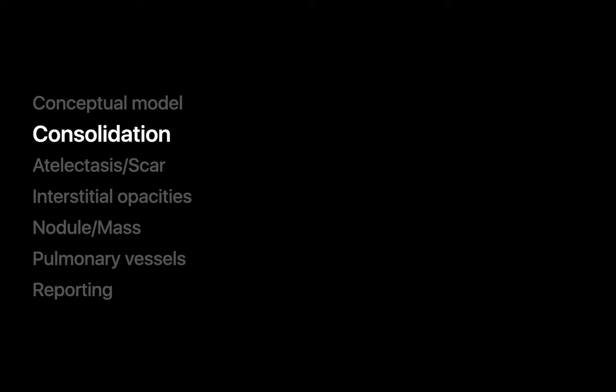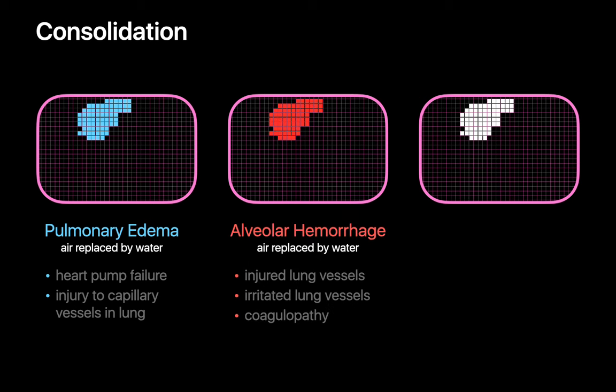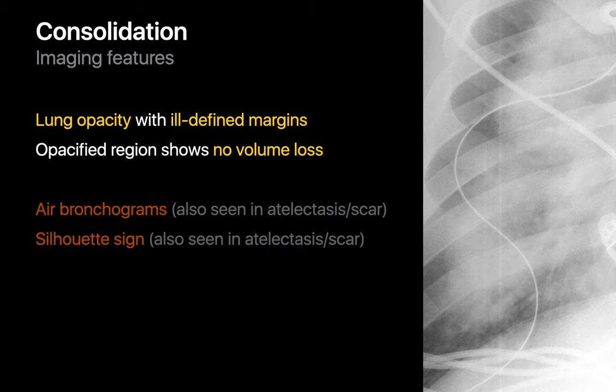When consolidation is present on a chest x-ray, it may represent pulmonary edema from heart failure, or capillary leak edema from injured capillary vessels in the lung. It may represent alveolar hemorrhage from injured or irritated blood vessels, or in the setting of a coagulopathy. The consolidation may also represent pneumonia. The customary appearance is a lung opacity with indistinct margins not associated with local lung shrinkage, though it can be tough to exclude volume loss with smaller opacities.